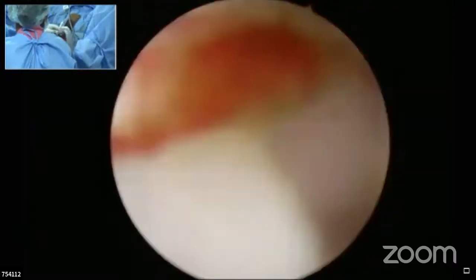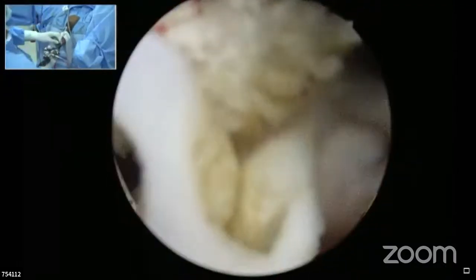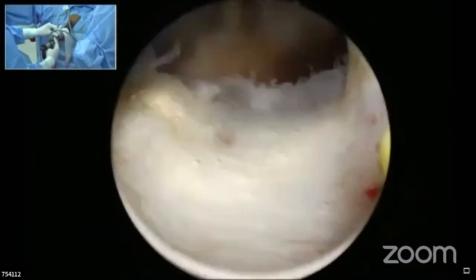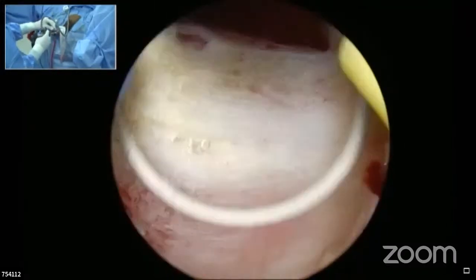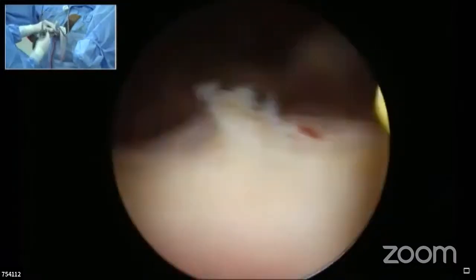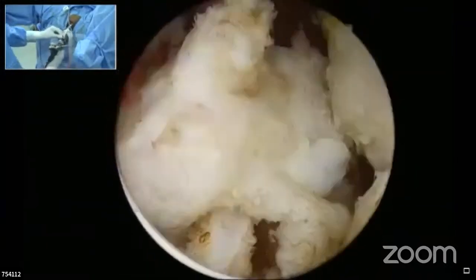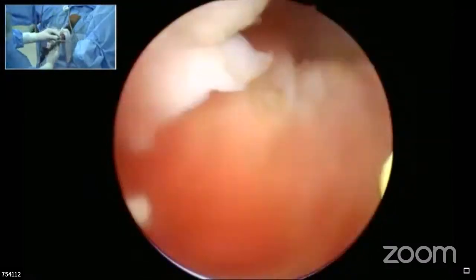With all the new technologies emerging for management of BPH, resection is still going to remain a mainstay for average urologists. And so they must know how to do a big gland like this. But what's happening is the industry is driving the younger people towards laser. This is what Krishnamurthy wants to say, and it is the same I want to say.